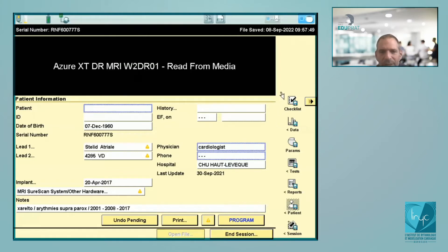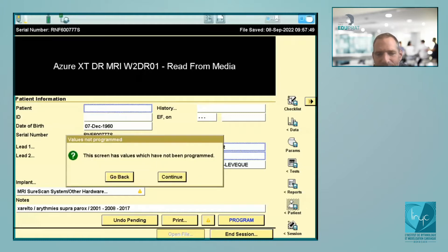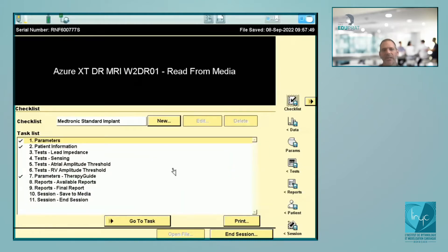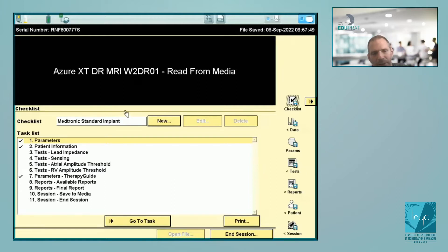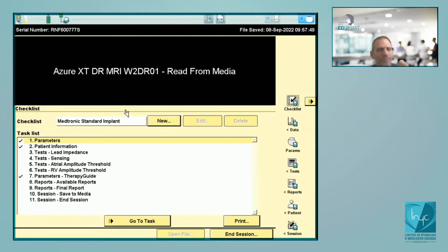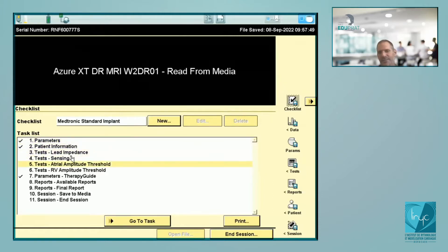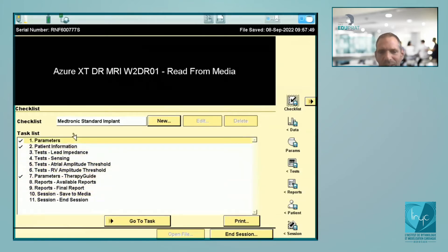If you go back and click on the checklist, if you have never interrogated a pacemaker, Medtronic proposes the different steps of interrogation: first the parameters, then patient information, and then the tests — lead impedance and so on. You can follow these different steps. Usually that's not the way we do it, but it's a good guide for beginners.